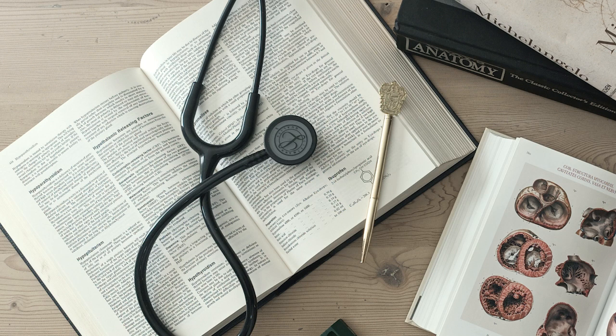So starting with the simplest, first-degree heart block, what's happening here and what does it look like on the ECG? First-degree heart block is, at its core, a simple, consistent delay in conduction through the AV node. All impulses from the atria do eventually conduct to the ventricles, but they do so slowly. On the ECG, the defining feature is a PR interval that is consistently prolonged. It's longer than the normal upper limit, which is typically 0.20 seconds or 5 small squares on standard ECG paper, and it's prolonged relative to what you'd expect for that heart rate. Consistently long PR. Consistently long, same duration for every beat.